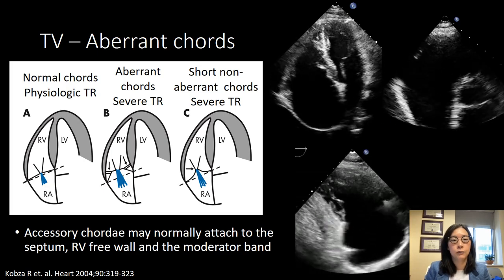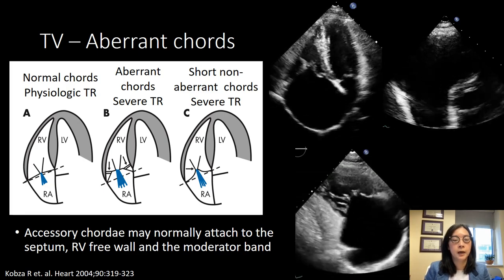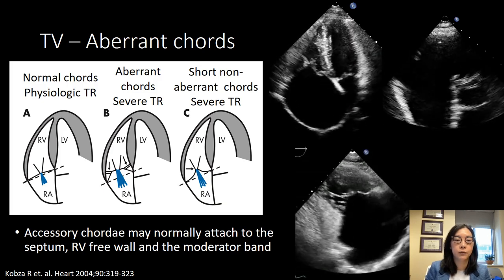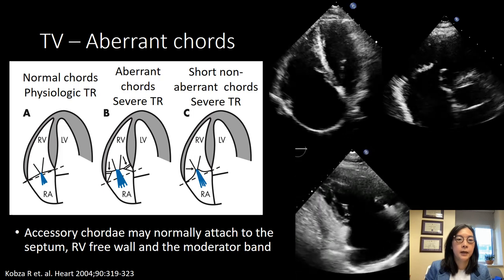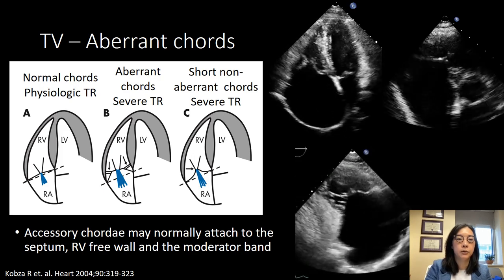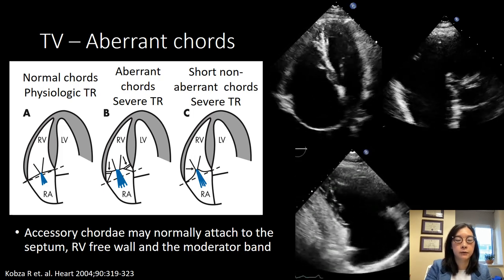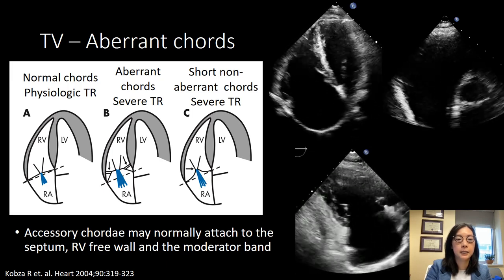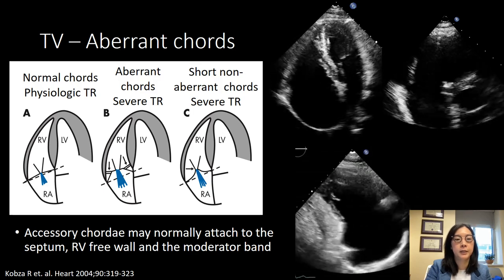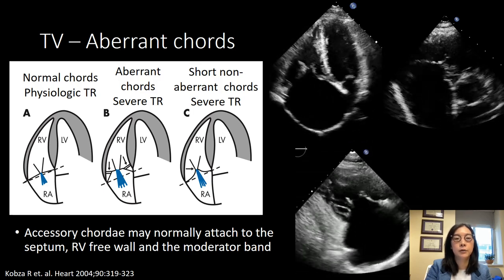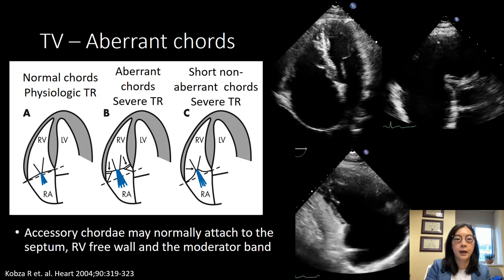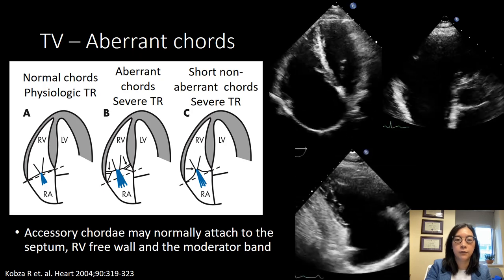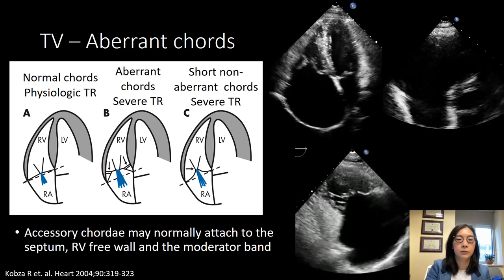The tricuspid valve may have normal as well as aberrant cords. Normal cords are attached at the edge, and accessory cords can also be seen attached to the septum, free wall, and moderator band. Aberrant short cords can lead to severe tricuspid regurgitation; these cords are generally attached to the body of the leaflet and displace the jet from the annular plane into the right ventricle. Short non-aberrant cords attached to the edge of the leaflets can also result in tethering and displacement of the jet into the right ventricle.